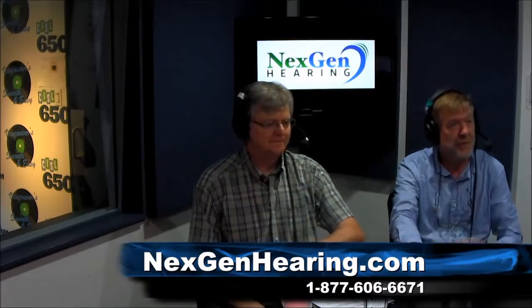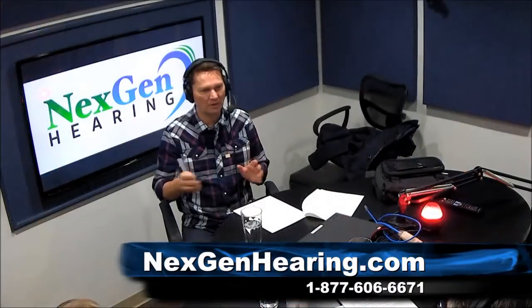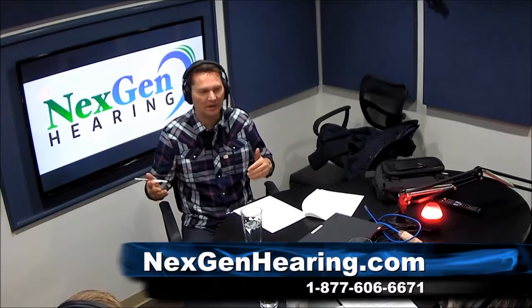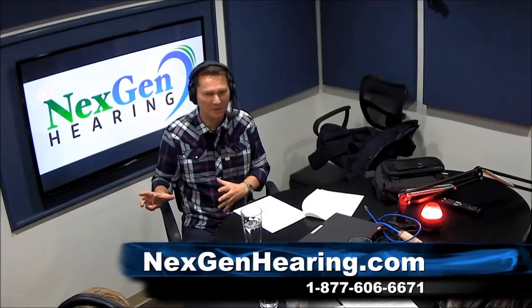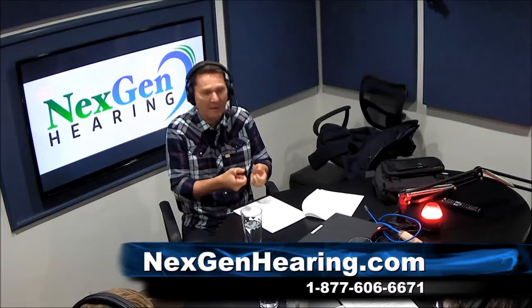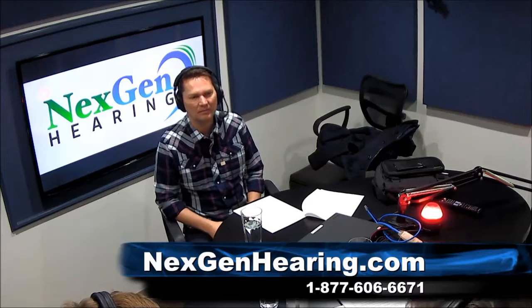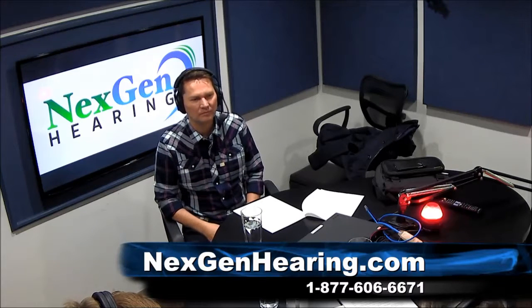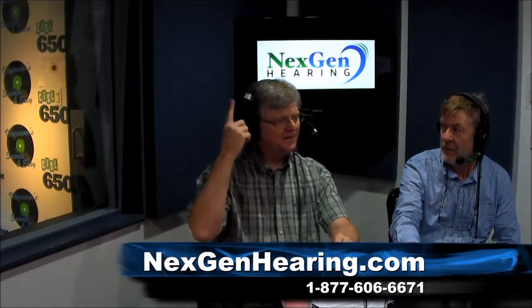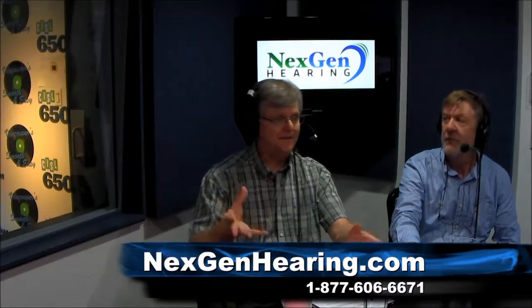Now, is this a system that you can go without? Like, the hearing aid is in your ear. So when you're out doing your regular stuff and you don't have somebody with you, you can just keep it in your pocket, I guess. Yeah. And how is it controlled? It's a separate unit. Right. You can just turn the power off, put it in its little case or pouch. When you want to use it, you turn it on, and then push the button on your hearing aid, it activates it, and then it's ready to use.